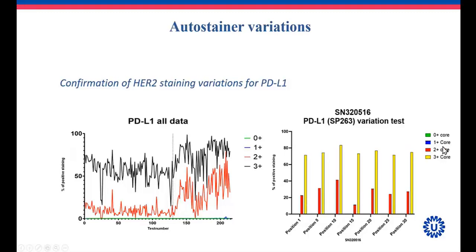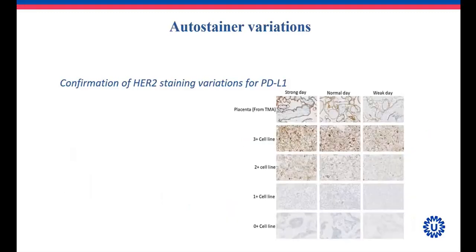And again, especially for the 2+ score, you see there is way too much variation between the different positions within the same stainer. So that makes sure that it's not just HER2. This also applies to PD-L1 and probably many other antibodies that you might use in your clinical practice. Again, to visualize this, you see here strong day, normal day, and weak day. And again, especially for the 2+ cell line, you see that there's way too much variation between a normal day and a weak day.